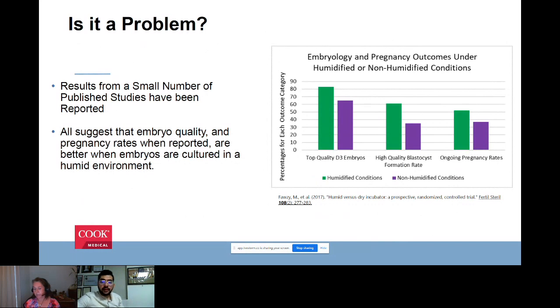Perfect. And so when we compare a box incubator with a benchtop humidified incubator, are there any differences between the two as far as the humidity is concerned? With the humidity, it depends. In the box incubator, obviously, I'm not going to talk about the fact that it loses temperature much quicker and your pH has a lot of problems coming back because of the loss of gas.